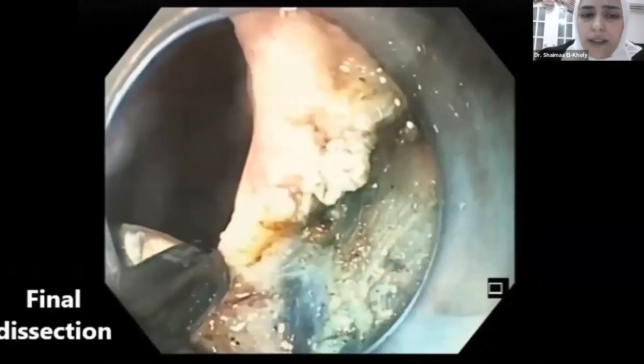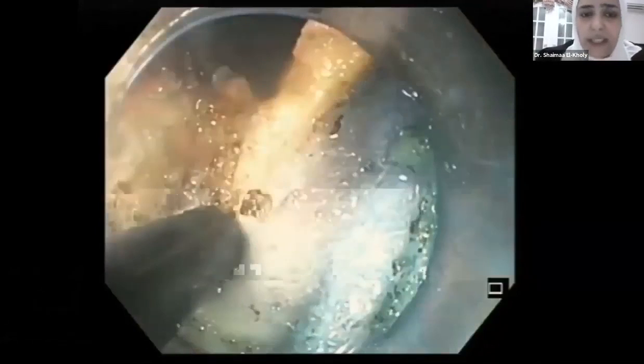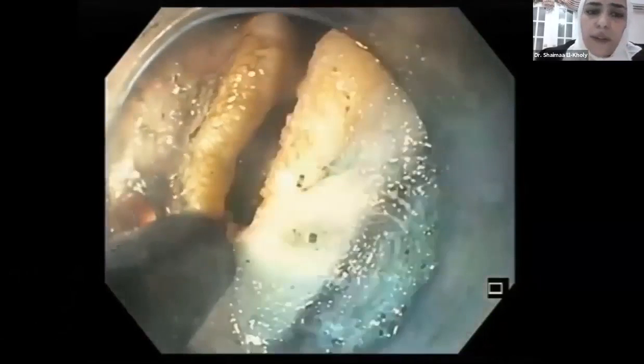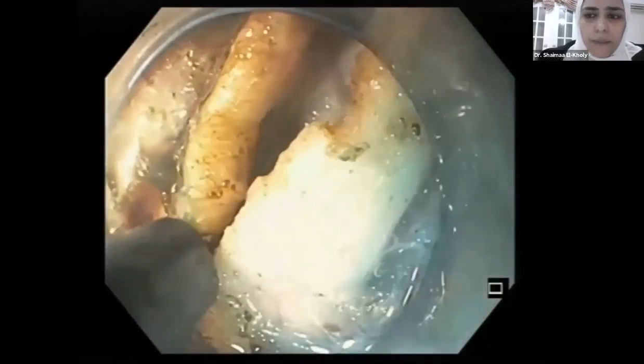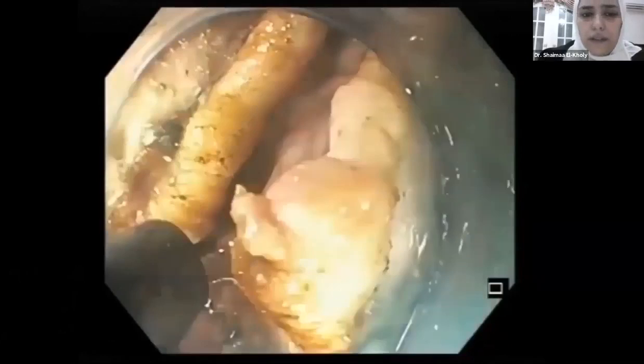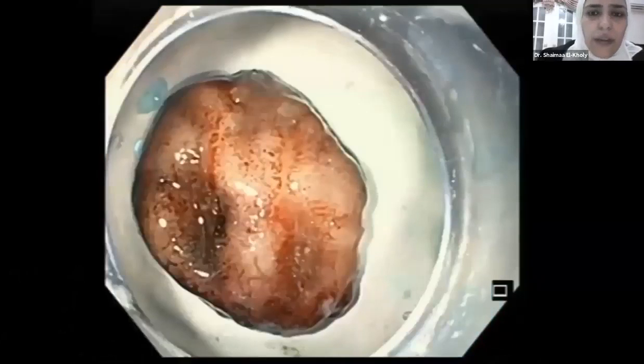Here we shift to the IT knife. This IT knife has an insulated tip knife. So we dissect with the shaft of the knife. As you can see here, that we are separating the lesion. And here is our final cut. So here's our lesion.